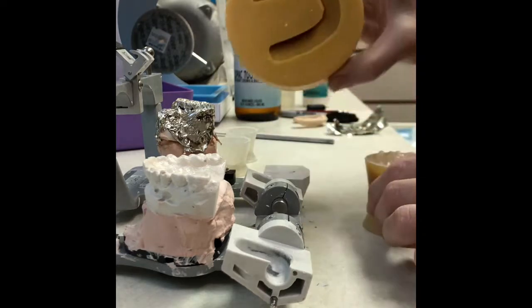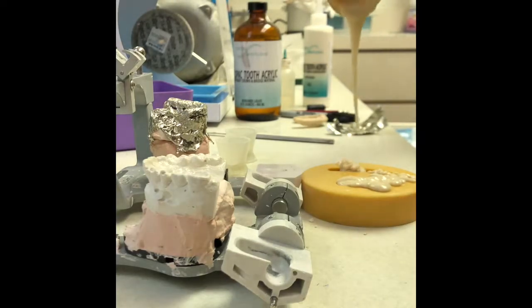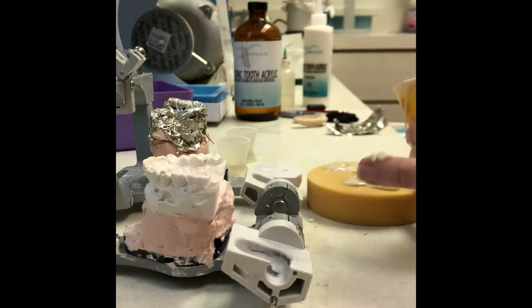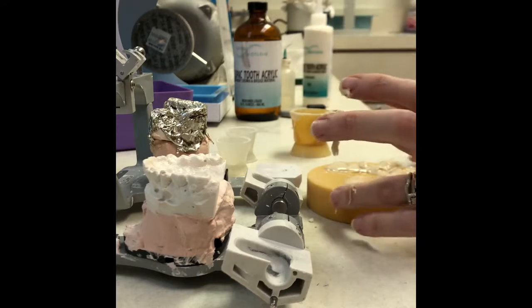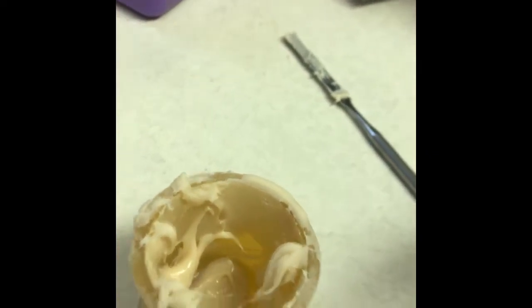Alright, now we're going to pour this into our former here. Let's see, it's already getting really thick. Should be able to pour it where it's really nice and thin and pourable, but mine's already starting to set up a little bit because I got the fan running. So you can see as it started out really runny, now it's getting kind of thick and stringy. In here, like that.